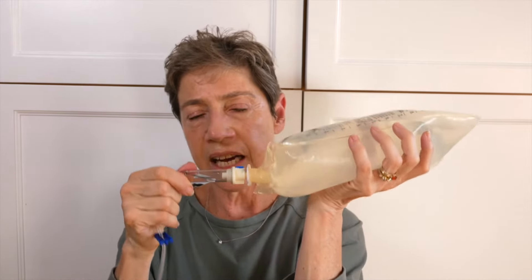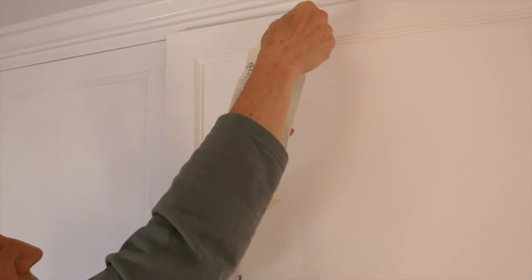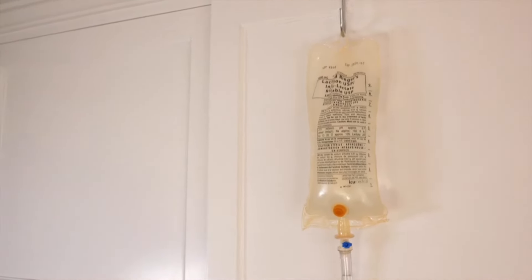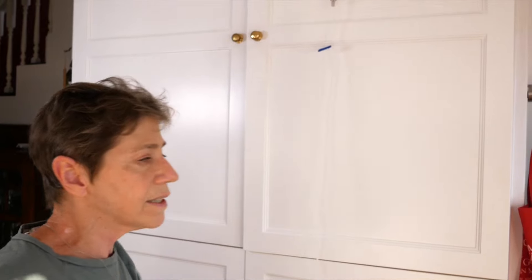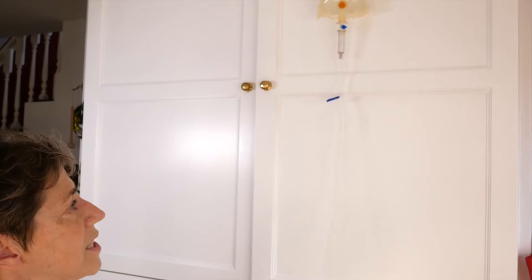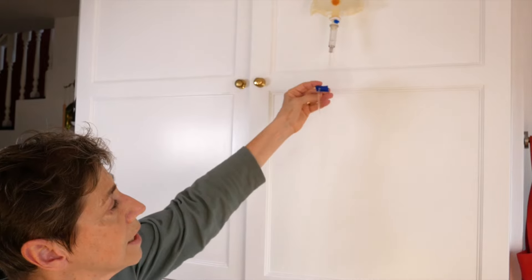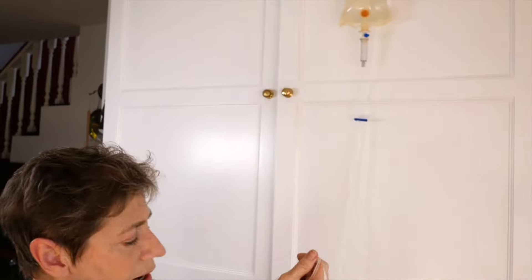Once you have attached the line, you cannot microwave it or you will end up with a big wad of melted plastic instead of a line. I'm hanging it up as high as I can because the higher it is, the faster the fluid will run. Pay attention to this bulb because that's where you'll see the fluid running later on when we're giving Nimitz his fluids. If your line has a tab like this on it, make sure that it is open and not crimped off.